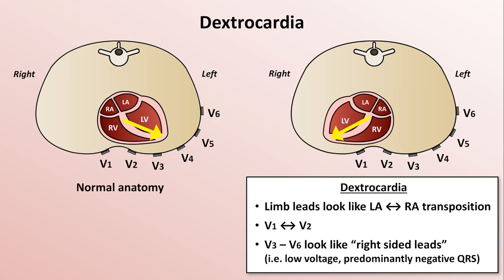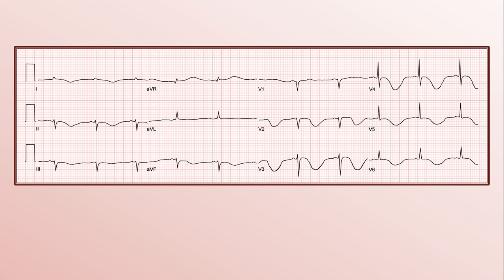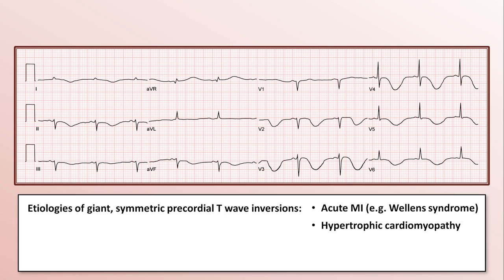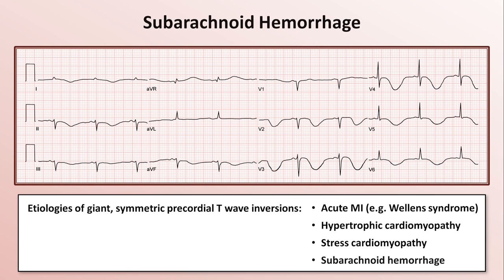An elderly person experiences loss of consciousness several minutes after the abrupt onset of a headache. Jumping right to the obvious, this EKG shows giant symmetric precordial T-wave inversions. The list of etiologies of this finding includes acute MI such as that seen in Wellens syndrome, hypertrophic cardiomyopathy, stress cardiomyopathy also known as Takotsubo cardiomyopathy, and the diagnosis in this case: subarachnoid hemorrhage.